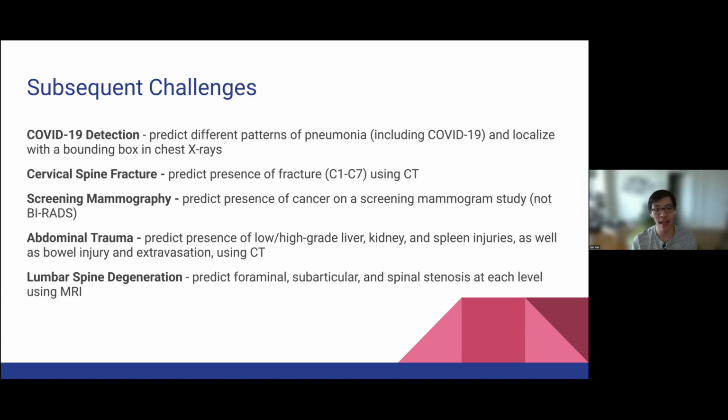The way they designed this challenge was they fast forwarded and looked at which patients had an actual biopsy and what the result of that biopsy was. So, was it actually cancer? Then they traced it back to the screening mammogram for that cancer. And the task was to predict whether there was cancer on the screening mammogram. So, we weren't predicting BI-RADS. And if you go to my Hugging Face profile, I uploaded a model that I trained for this competition as well that you can play around with.